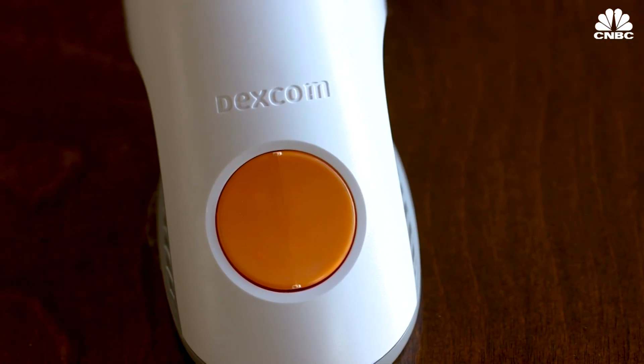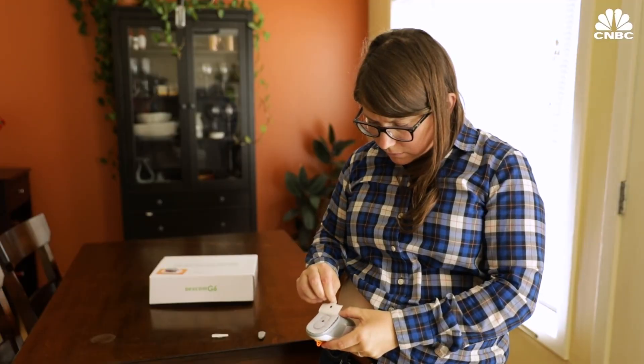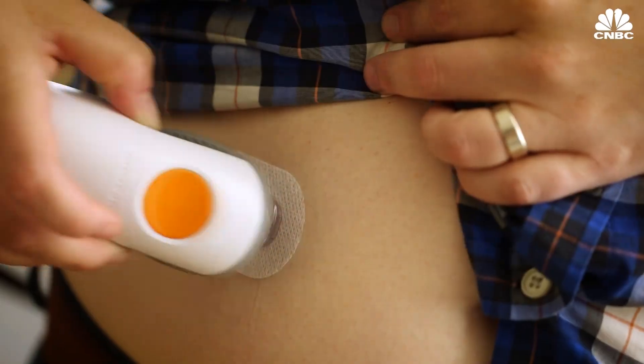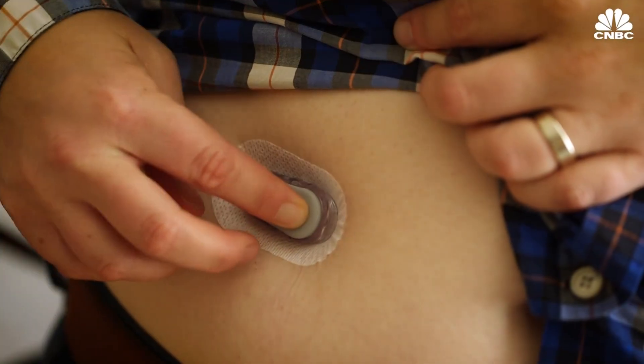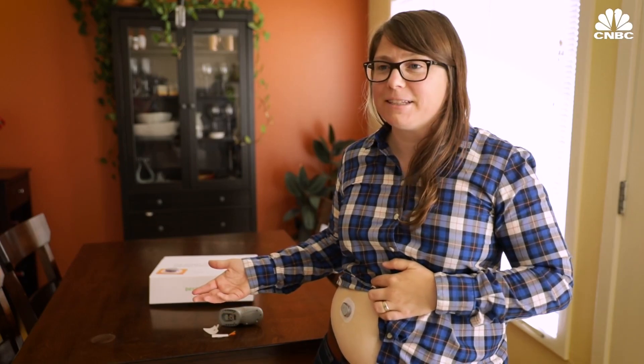First, we have to insert the sensor. You take it out of the package — it's kind of big and bulky, and a little intimidating. Didn't feel that at all. Once the sensor is in, you attach the transmitter. It's connected.